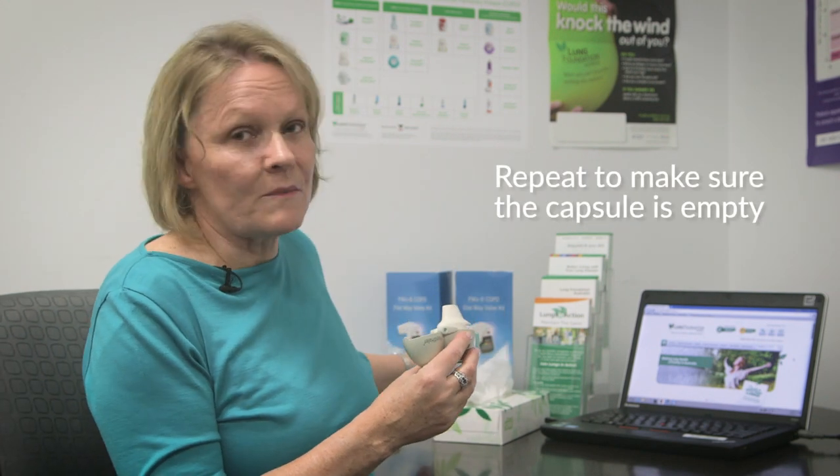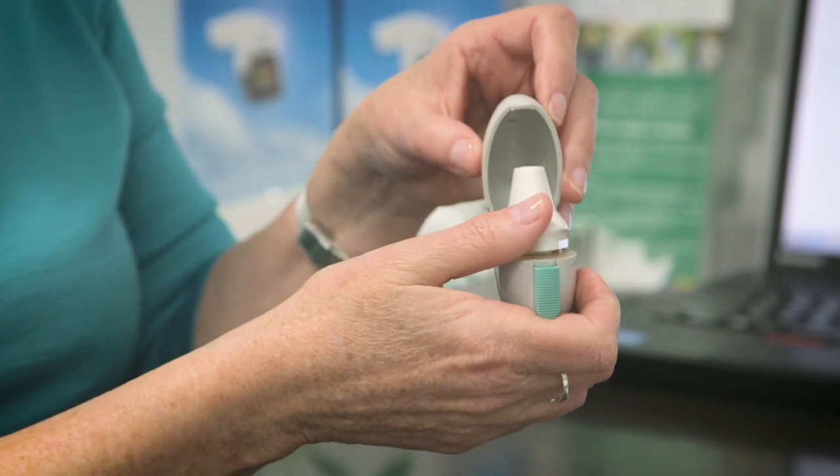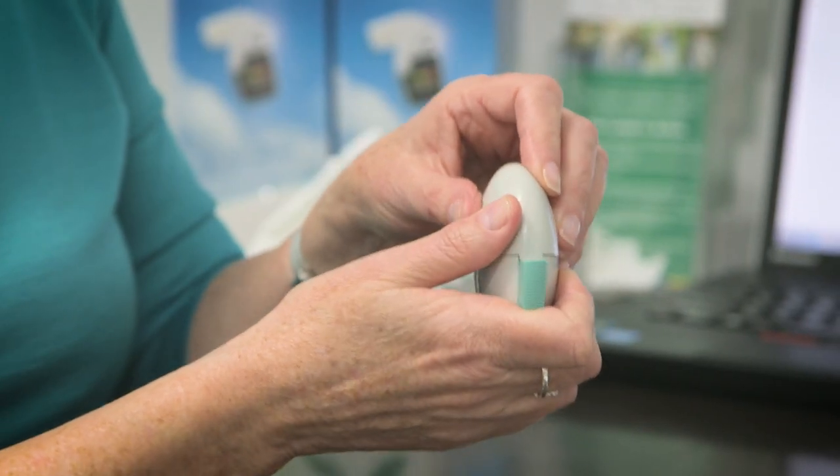You then wipe the mouthpiece with a dry tissue. Open up the mouthpiece, take out the capsule and discard it. Close it up and it's ready for next time.